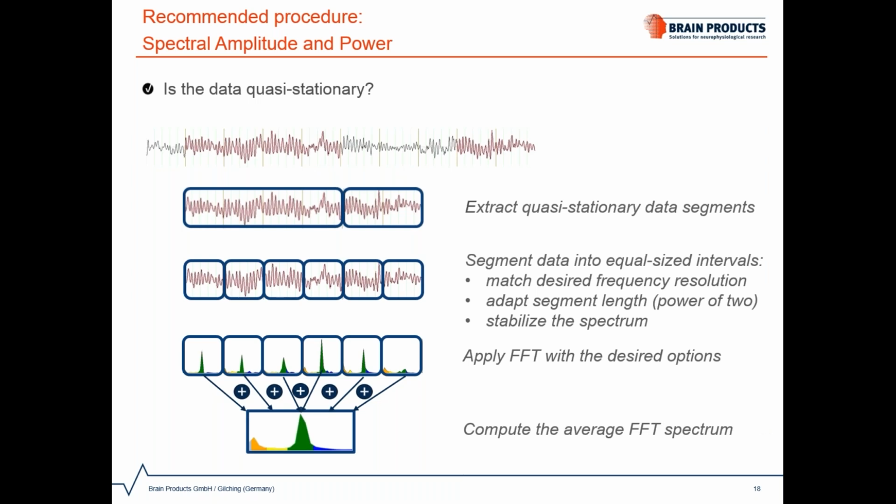This will improve the signal-to-noise ratio by averaging out the residual intertrial variance. You can easily relate the procedure of averaging to an ERP analysis, for example, where you would average across segments to improve the signal-to-noise ratio in order to obtain a reliable ERP component.